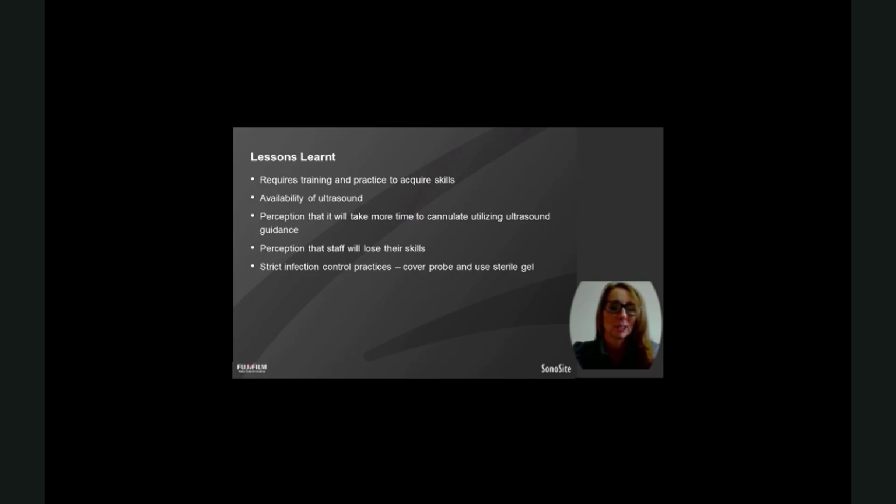So really good ones are patients who are on dialysis with a central line and have a fistula that's maturing. You put them on their dialysis, and then in that downtime you can go over while they're on dialysis and scan their arm and not have them waiting.